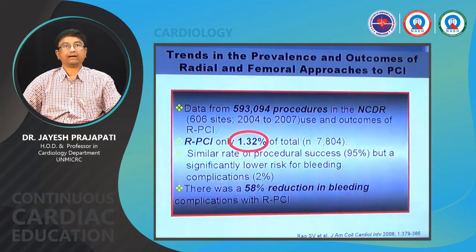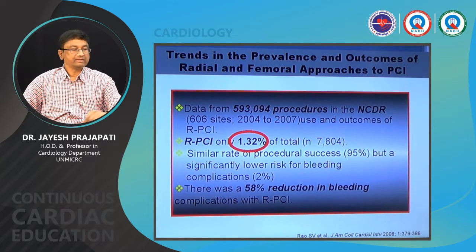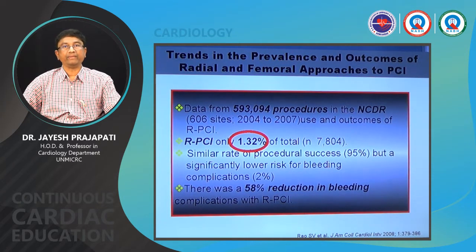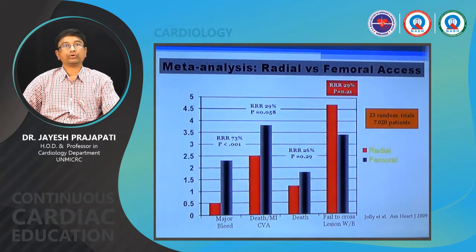And one thing is that always give heparin. And one thing is that radial artery pulse loss is related to your sheath size. So always keep your sheath size to the minimum. With a 5 French sheath you do the diagnostic procedure, and if intervention is required, then go for a 6 French. Never take a 6 French directly to avoid money, because with 5 French the radial artery occlusion rate is lower compared to the 6 French. So always keep that in mind. So I will show the sheath size and related things. So radial sheath size, that we always have to keep in mind.